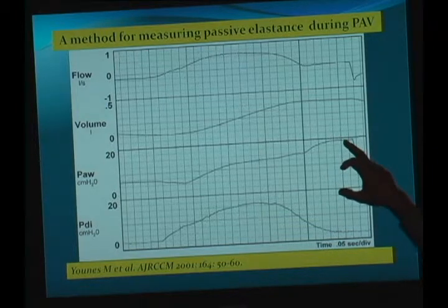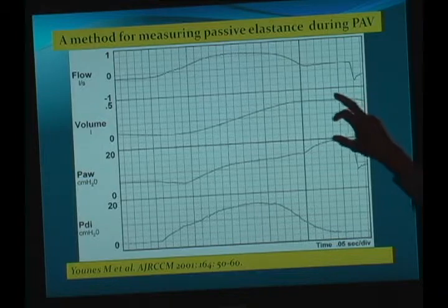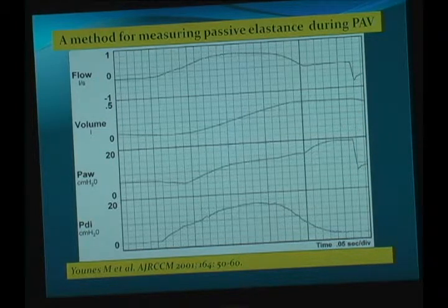So with this pressure and this volume, you can calculate compliance, and because of the previous flow, you can calculate resistance. So the machine goes thus in a random way, every 3, 6, 7 breaths. It introduces this interruption to continuously calculate mechanics. And then you can say only, I want to multiply this by a certain percentage.